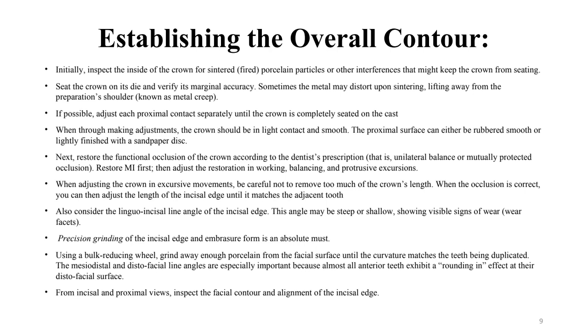So those areas, when people smile, sometimes it's not that they don't have teeth; they have teeth, but the arches are narrow, so there is a space between the cheek and the teeth, and that's called a negative space, and it looks like a black space. Also, when we do the gingival embrasures, we need to take into account how much space we leave.